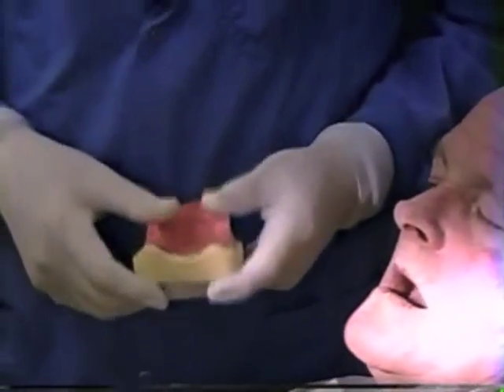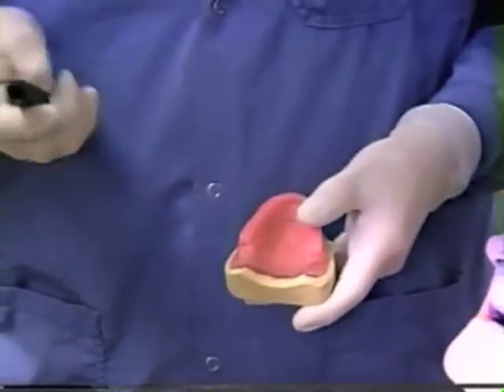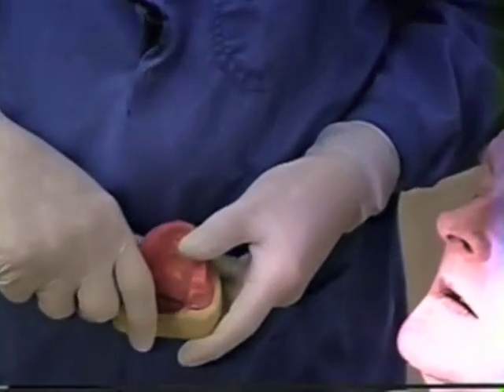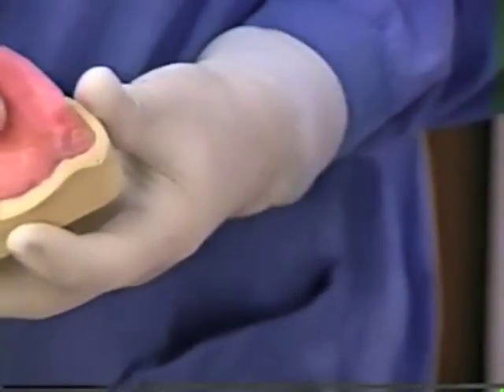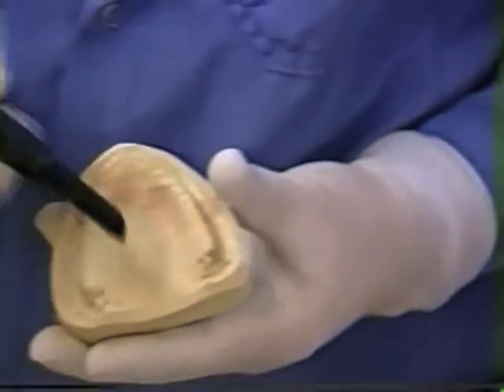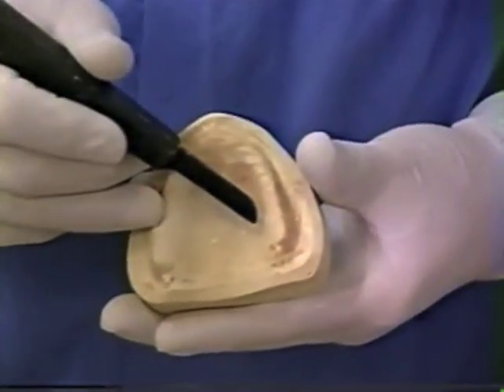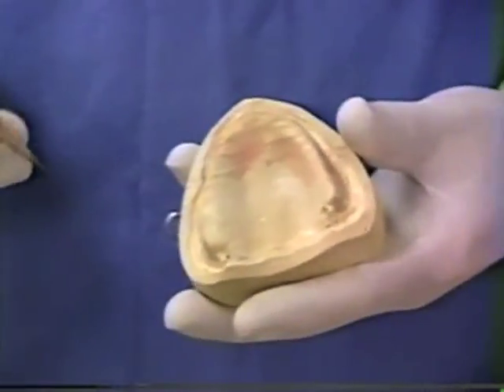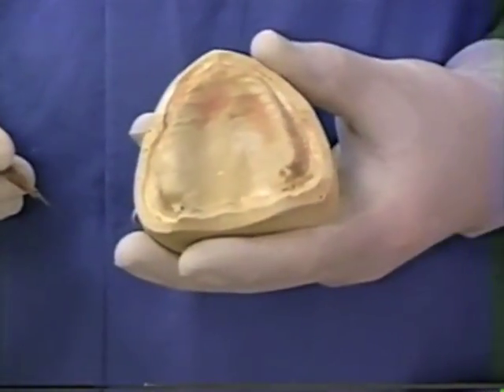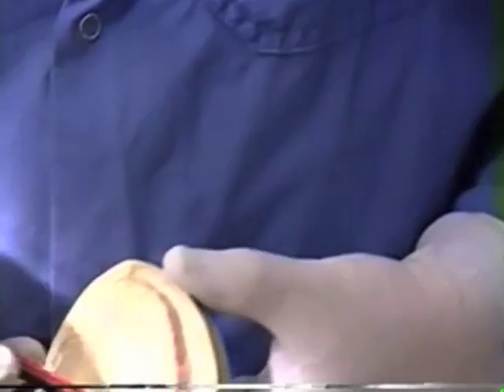Now we're going to transfer the information we've gathered to the master cast. We do that by seating the base plate back onto the master cast, take your buffalo knife — the wooden handled buffalo knife — and just score the cast exactly at the end of where we cut the base plate. This line now represents our posterior limit of where we want the denture to go, at the junction of the movable and immovable tissues. We have palpated in the patient's mouth for a layer of glandular tissue that is displaceable — that's the area we're going to displace with the denture to create the posterior palatal seal.